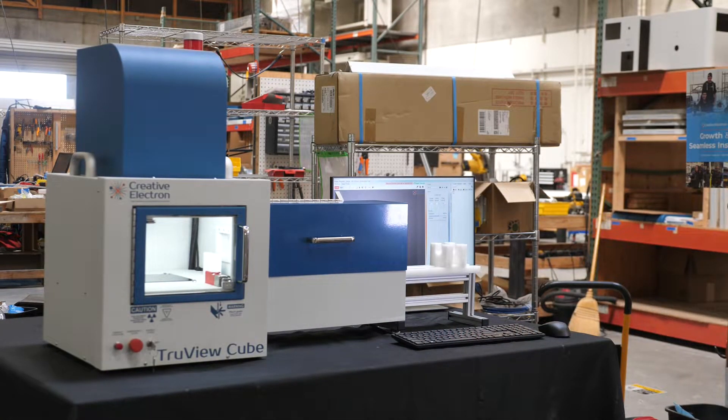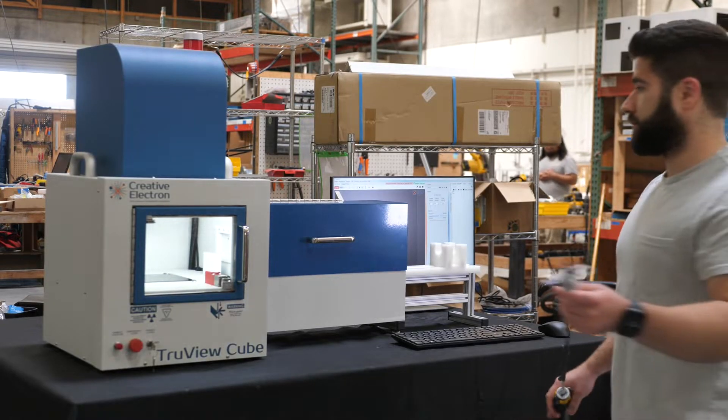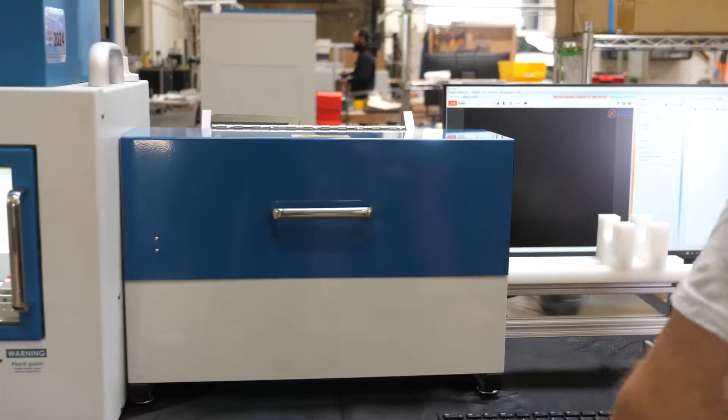Hello everyone! Today I will be showing you our TruView Cube catheter tip inspection system.